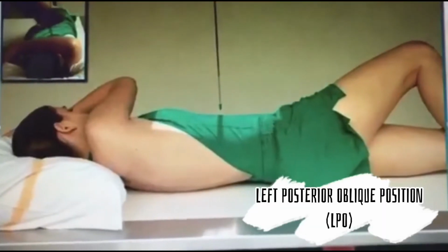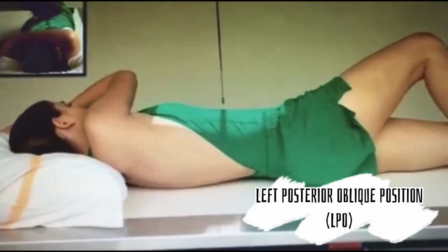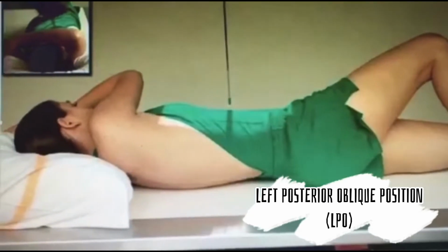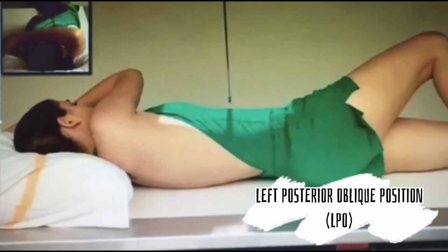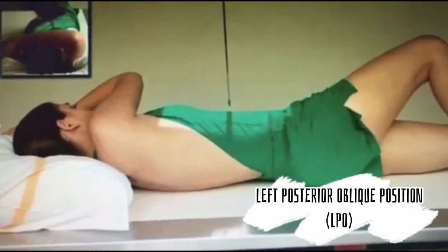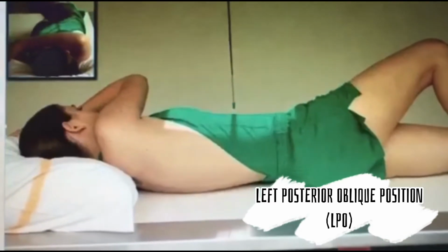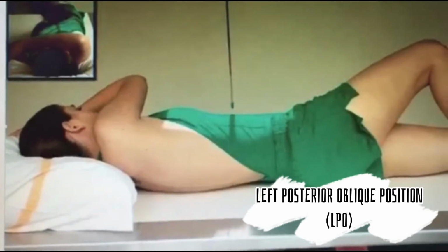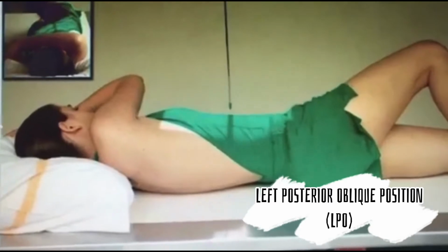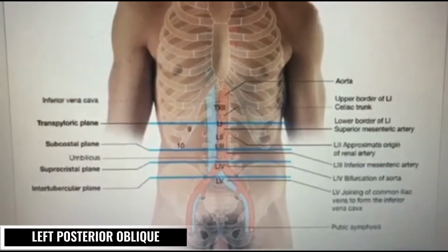The next position is the LPO position. When the double contrast technique is used, the air-filled pylorus and the duodenal bulb may be better demonstrated, showing signs of gastritis and ulcers. The technical factors we use are a minimum SID of 40 inches and an IR size of 24 by 30 centimeters or 30 by 35 centimeters. Here I'm going to discuss the central ray for the LPO position.